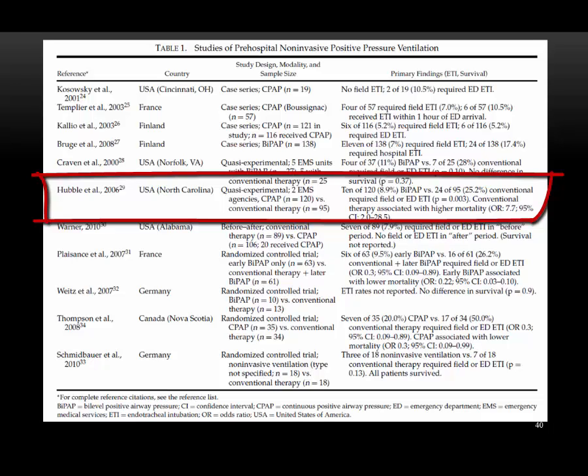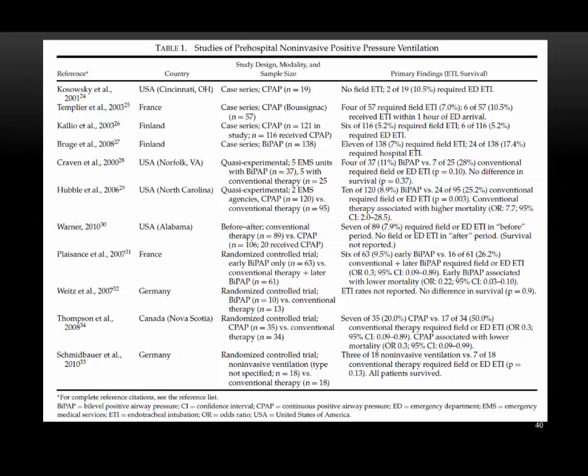Accounting for the cost of CPAP equipment, including the cost of the CPAP generating system, disposable mask, and tubing for each patient, training of the personnel, and oxygen usage, the authors estimated that the cost benefit of pre-hospital CPAP was $490 per life saved. They also predicted that CPAP would reduce hospitalization costs by $4,075 per year per application. And now, a video on CPAP.